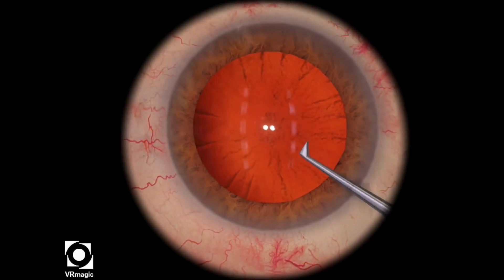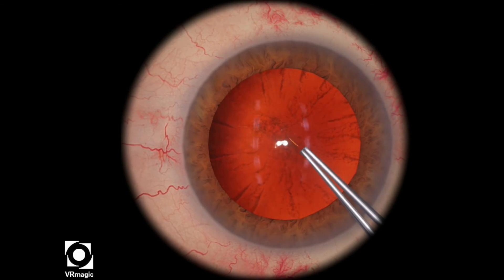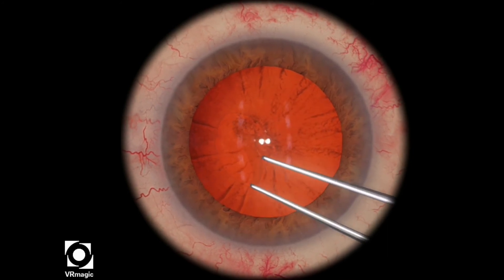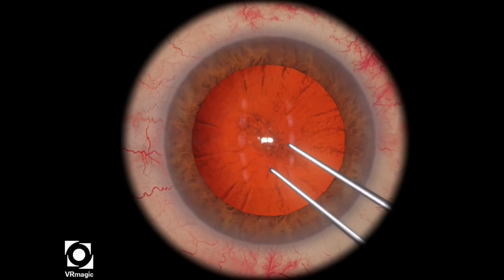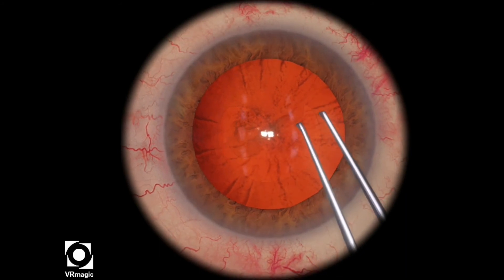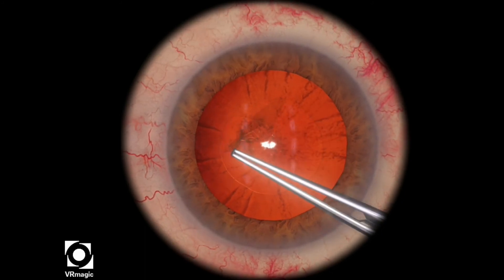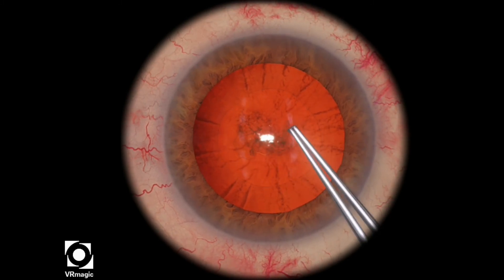So we just put in the viscoelastic, look at the center, and do a backwards 7. Try to pull towards the center using a ripping technique, and then continue pulling towards the center repeatedly until you complete the rest of the rhexis.